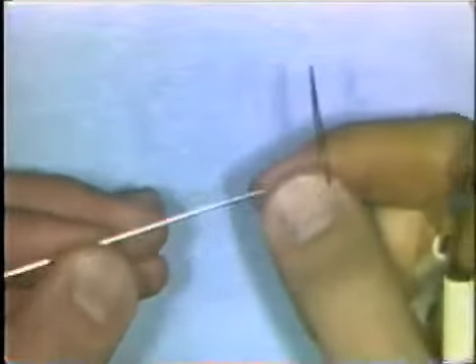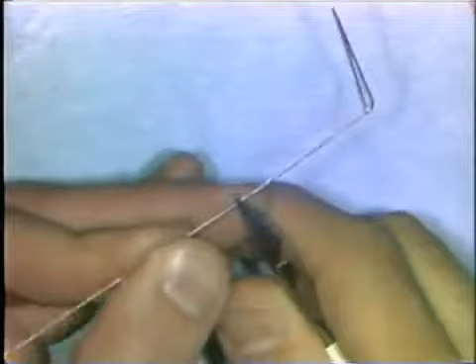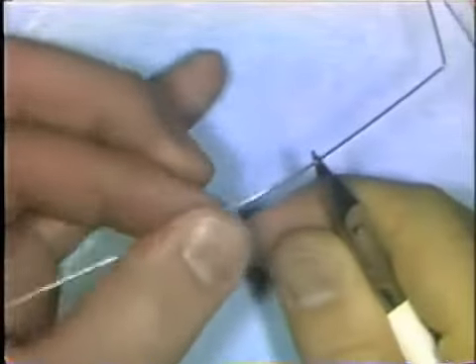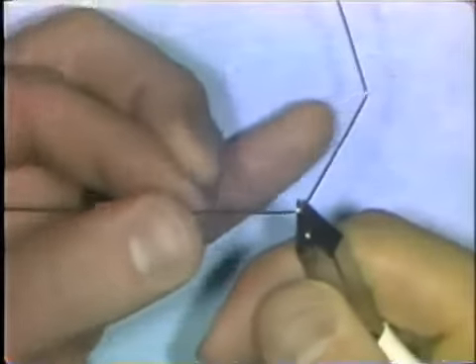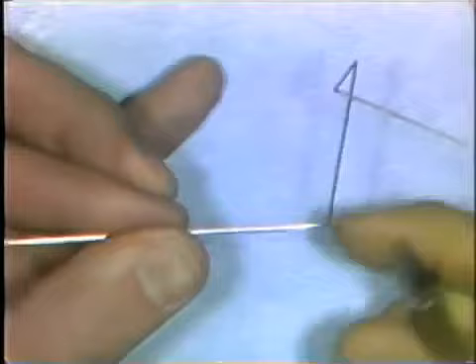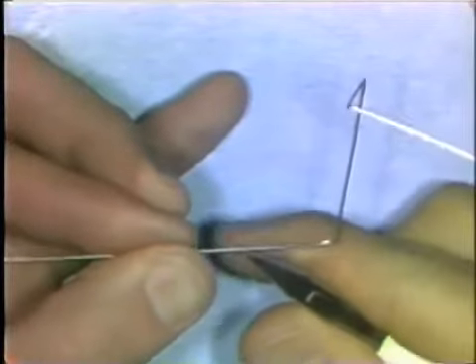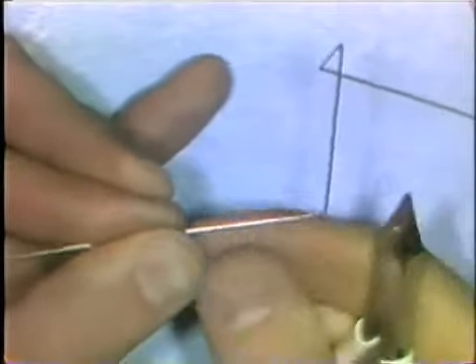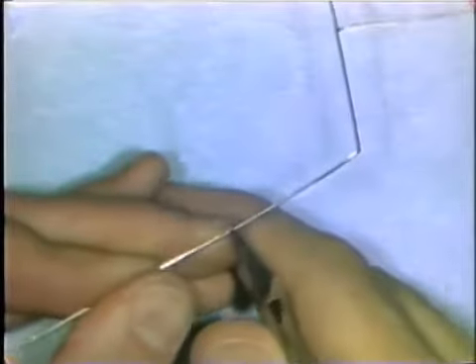Secondly, when you make a right angle bend, don't distort the straight sections of the wire by pushing with your fingers too far away from the beaks. If you push away from the beaks when you're making the bend, it's possible to end up with a straight section of wire coming into the bend and a curved section of wire coming out. And this is a little inaccuracy that you can avoid with the placement of the fingers in the right spot.